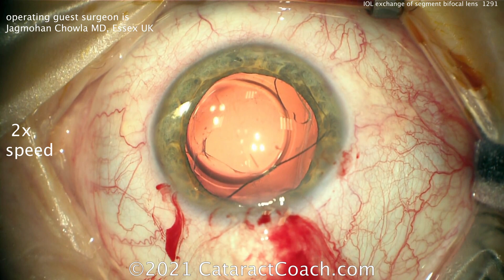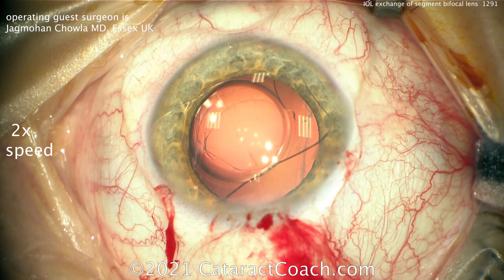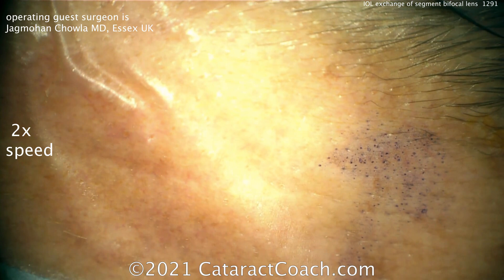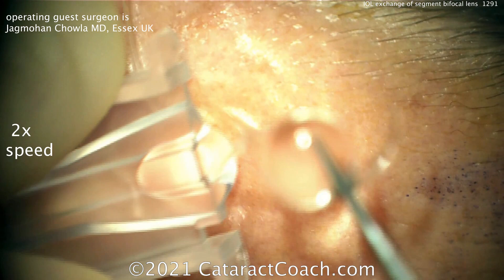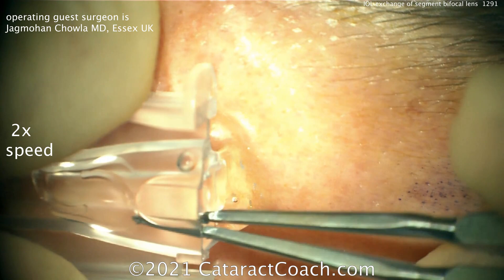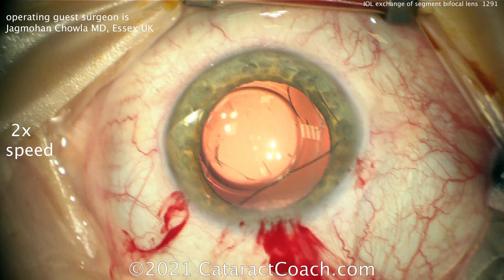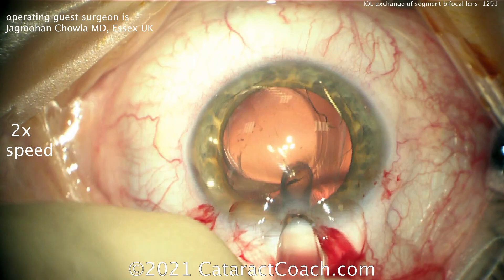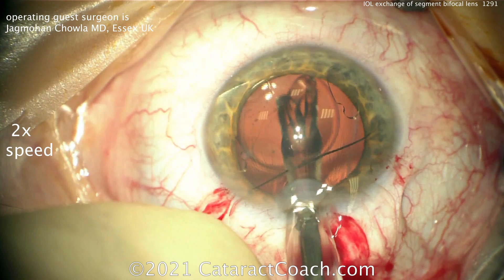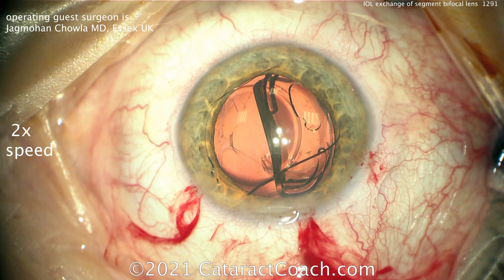In a case like this, you also want to take into account the astigmatic effect — perhaps this patient had a little with-the-rule astigmatism, hence the incision up at 90 degrees. A little HPMC (hydroxypropylmethylcellulose), a very dispersive viscoelastic, is placed on top of the cornea. It looks like we've got a Johnson & Johnson Tecnis injector cartridge — perhaps a ZCB00 or eyehance lens. The ZCB00 would be preferred here since the patient's main complaint was nighttime vision. The new lens goes in nicely into the capsular bag in the correct orientation.